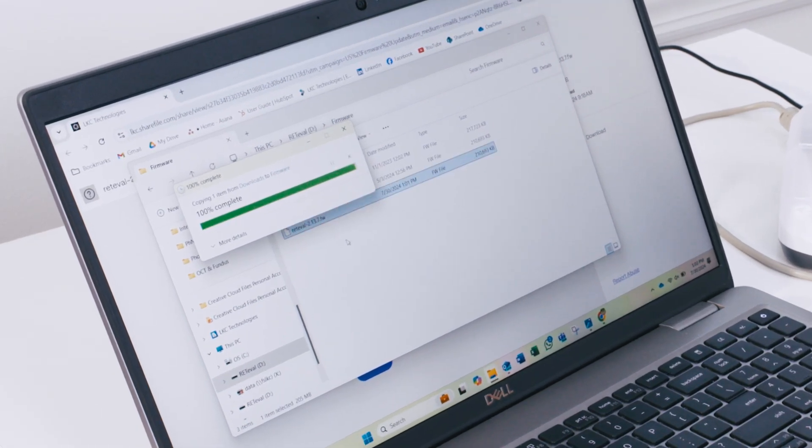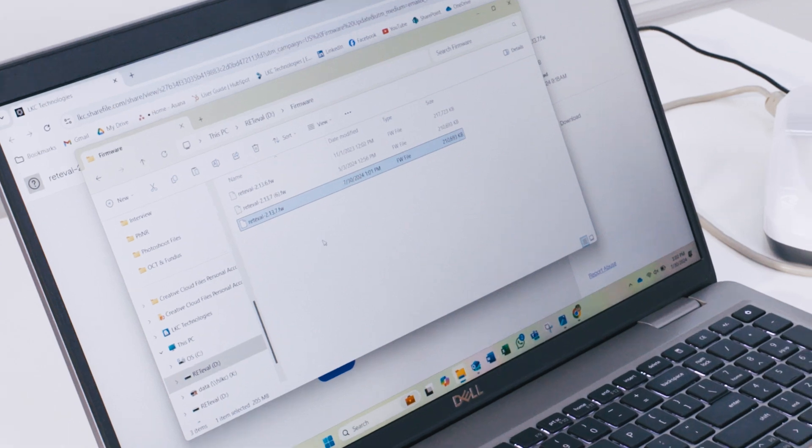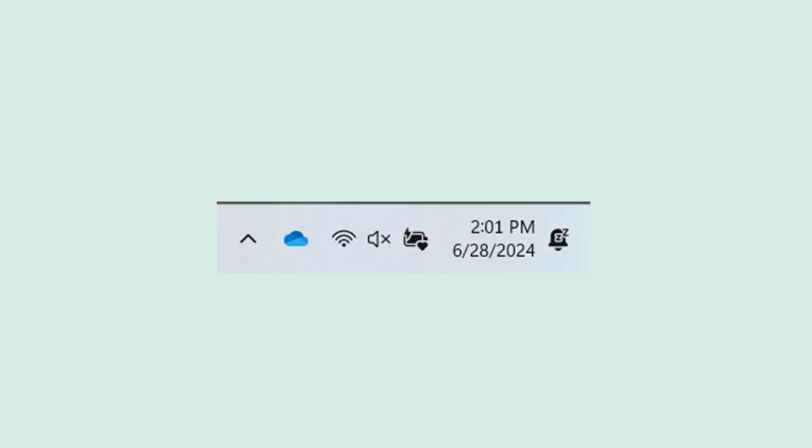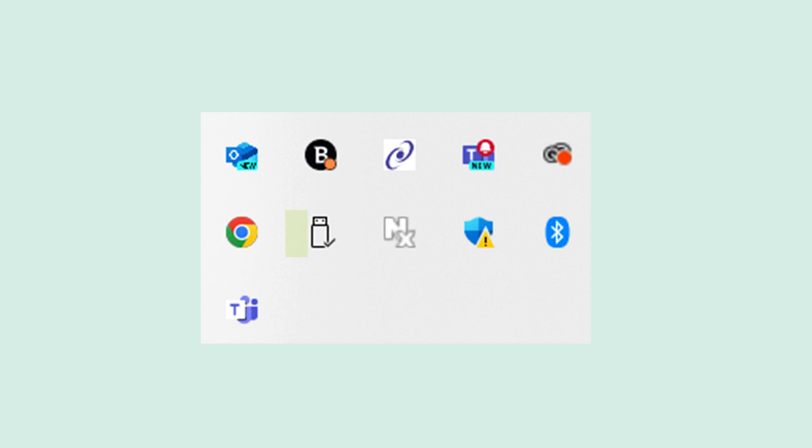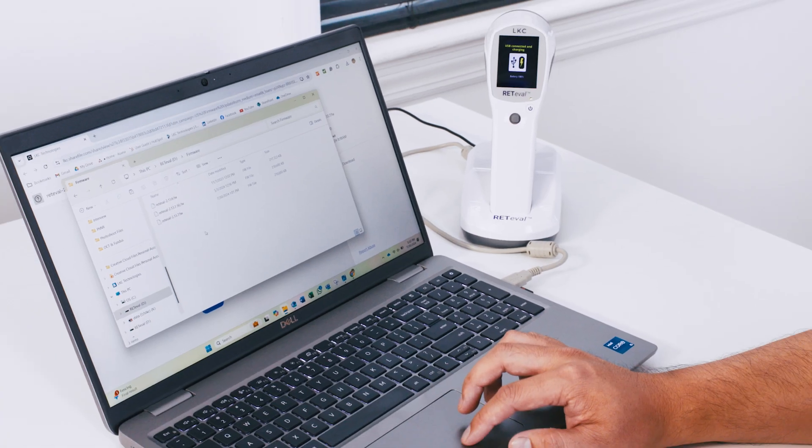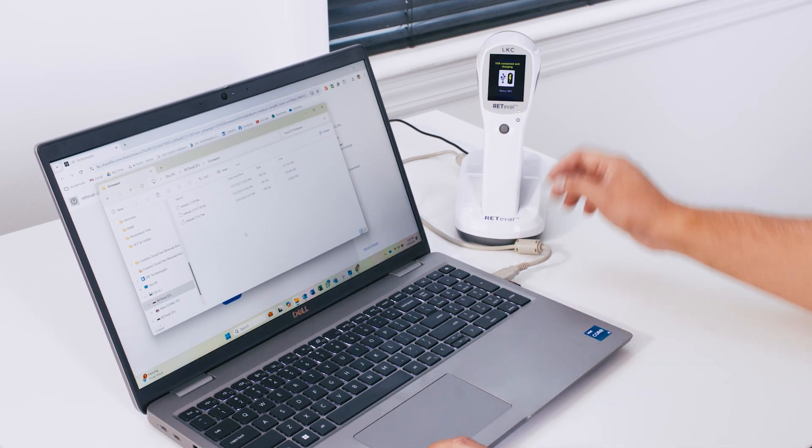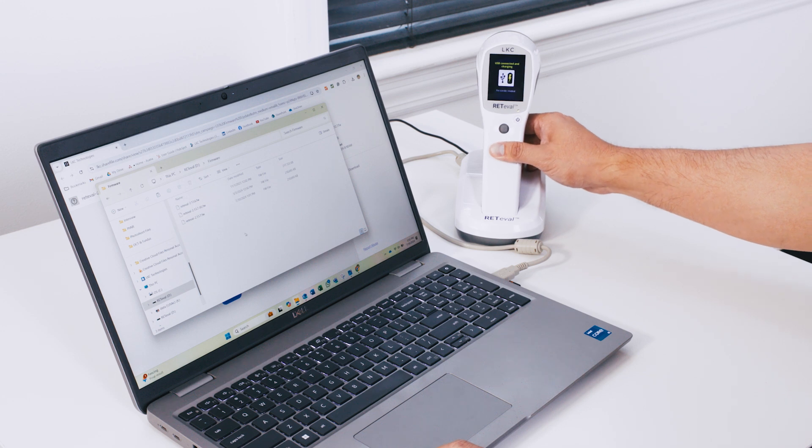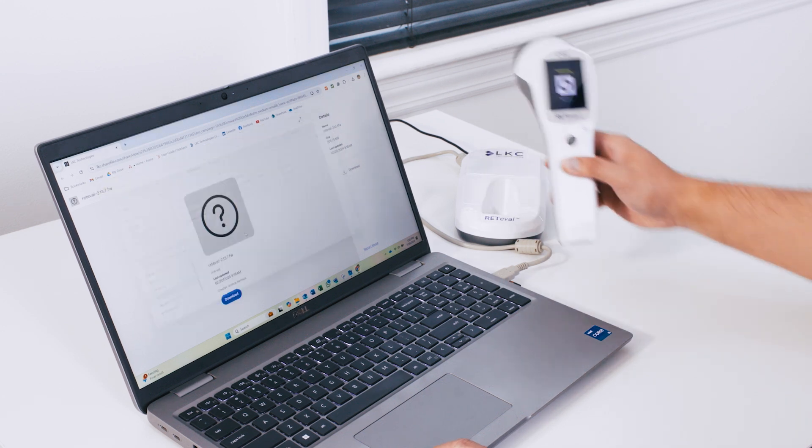you will want to safely eject the RETeval. At the bottom of your computer screen, select the up arrow, then the image that looks like a USB drive. When you hover over it, it will say safely remove hardware and eject media. Select eject RETeval, then remove your device from the docking station.